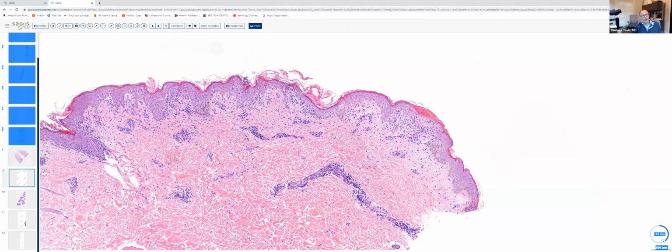I tend to view pityriasis lichenoides as running along a spectrum. A lot of times we'll refer to the entire spectrum as Mucha-Habermann disease, with pityriasis lichenoides chronica on one end of the spectrum and PLEVA on the other end. PLC is characterized by more scaly macules or scaly papules, and PLEVA by more crusted and eroded papulonecrotic type lesions. But the histology of the two conditions is actually quite similar. It's a matter of degree.